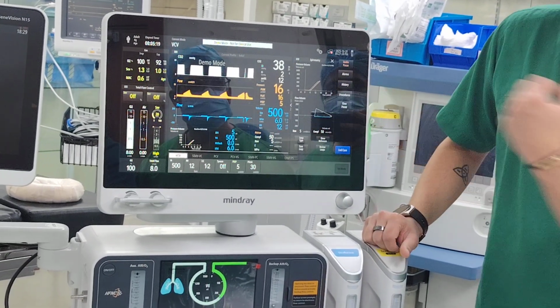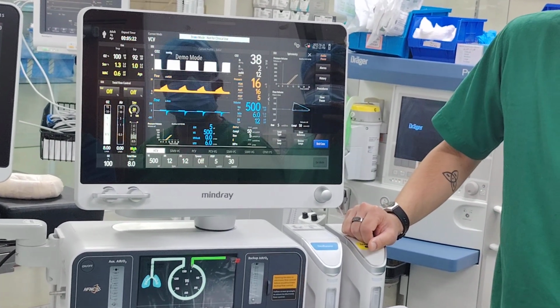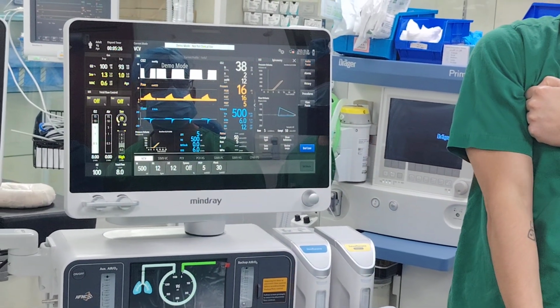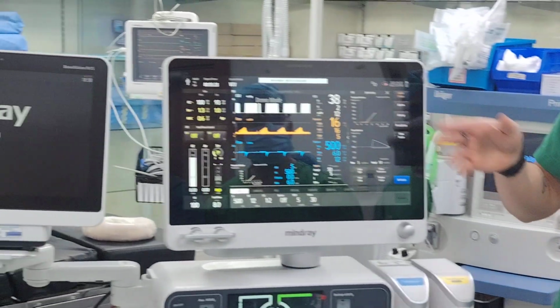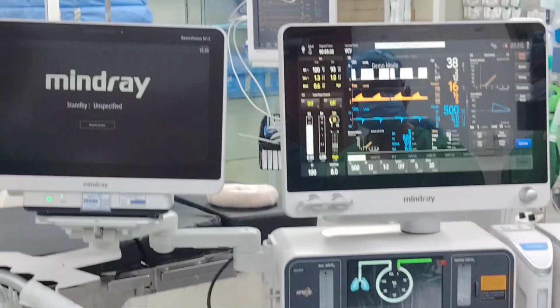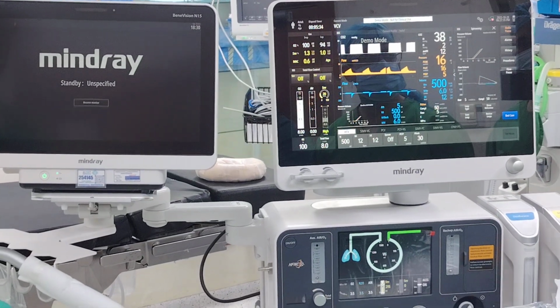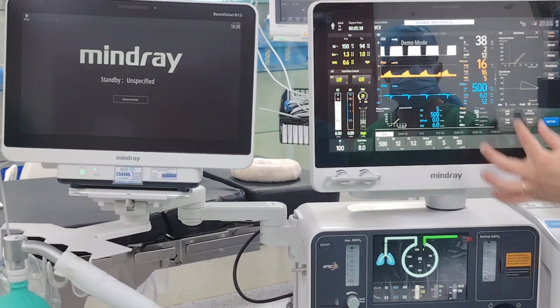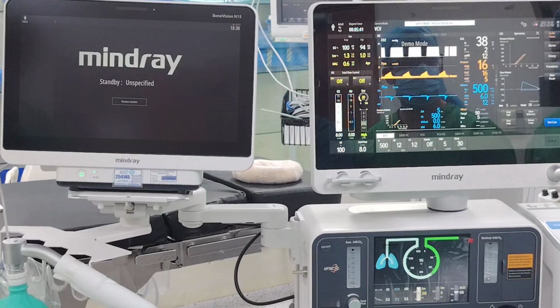You see the white one? The white one is the baseline right now. So when you usually intubate your patient, this is where you want to nicely take the snapshot of the patient. Now, this is very good for long cases. For short cases, it's nothing significant. But if you talk about 4 or 5 hours, the longer the case, the more chances of atelectasis. This is where it's very good. So you have one indicator for you to know if you want to do lung recruitment.